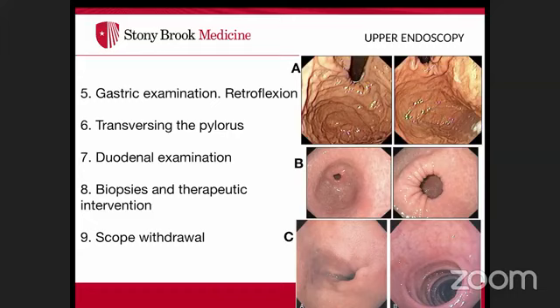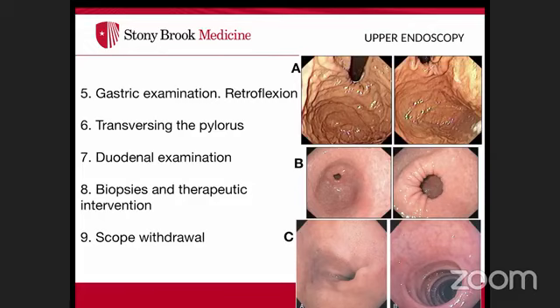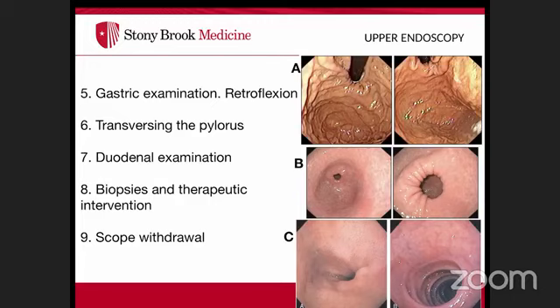Avoid over-inflating the stomach to prevent scope looping in the greater curvature. Identify the pylorus, keep it centered, push gently, and wait for peristalsis to subside. Once through, you'll enter the duodenum. Examine the duodenal bulb carefully — it's a common site for ulcers and bleeding.